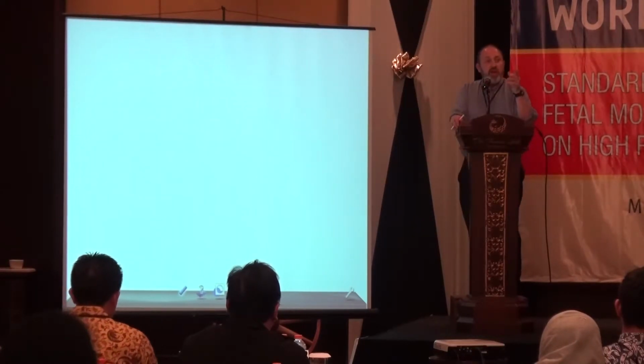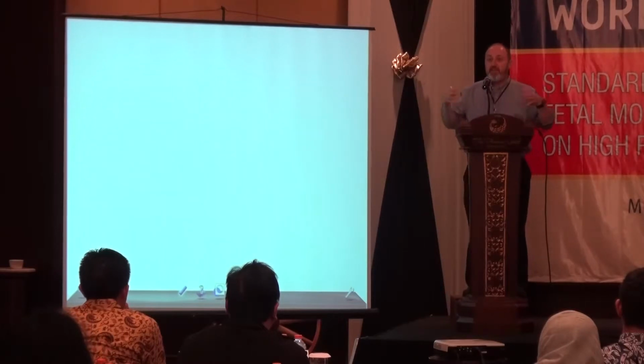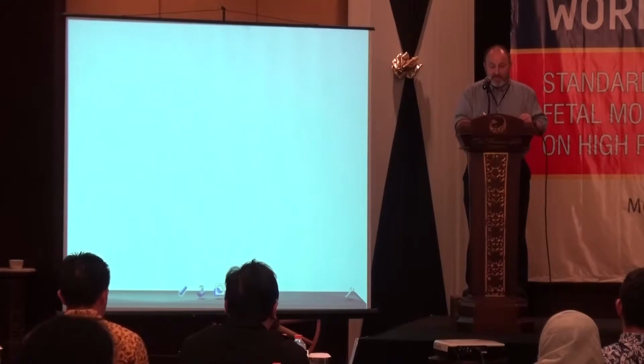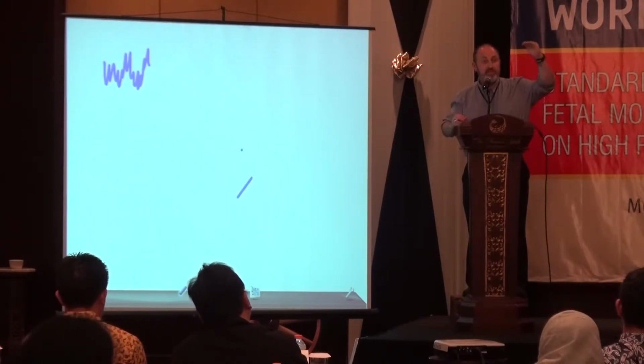Our colleague this morning gave the talk on the pathophysiology of the CTG. I said earlier on that the normal intrauterine pressure of the pregnant uterus at rest was about 12 to 20 millimeters of mercury. So there is pressure inside the mother's uterus when the uterus is at rest, and the fetal heart is beating along comfortably. As the contraction builds up, the intrauterine pressure rises, doesn't it?